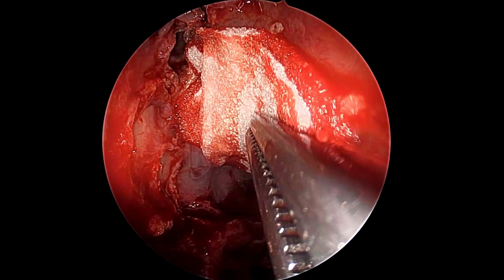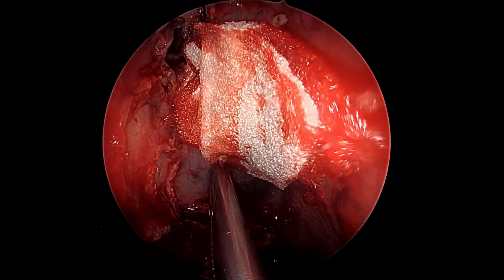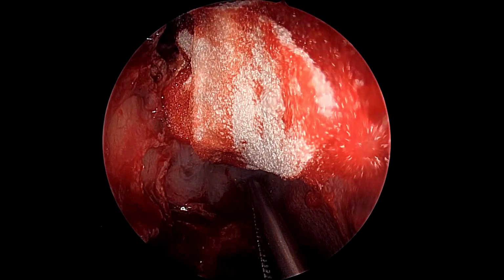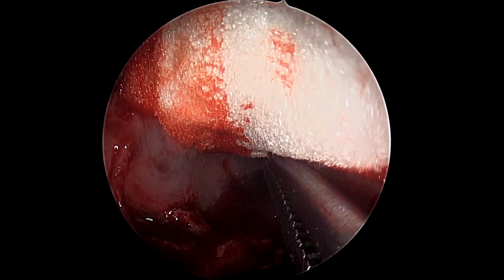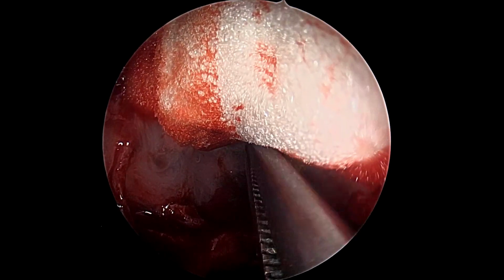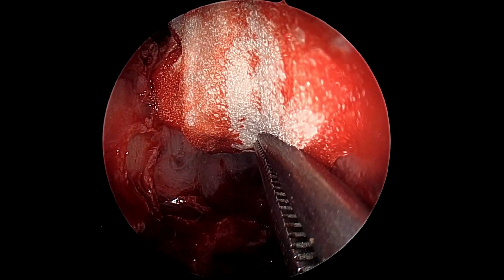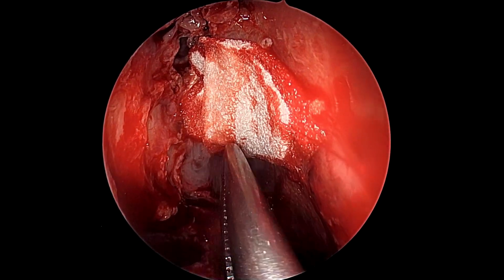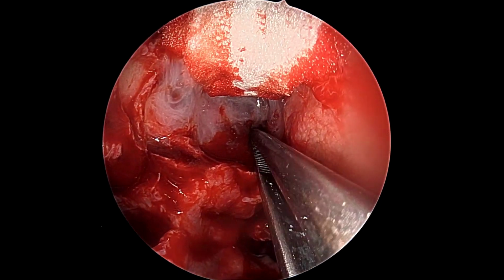So as we can see here, some more gel foam comes in the end to secure this on the edge of the septum anteriorly, and one can impregnate this gel foam with either saline or vinegar solution, or sometimes if you want even an antibiotic solution such as gentamicin.